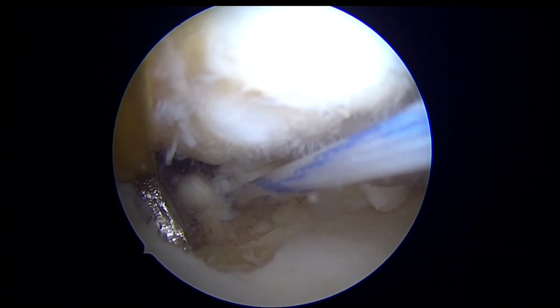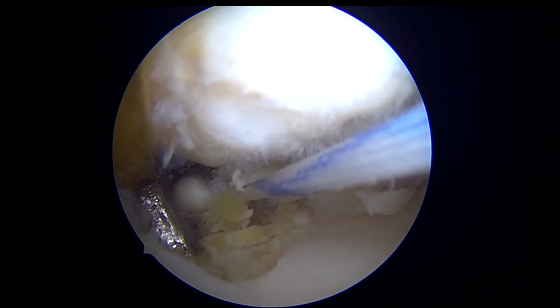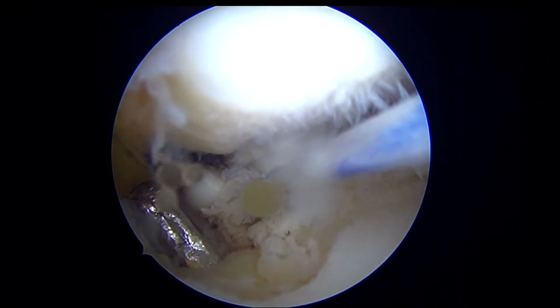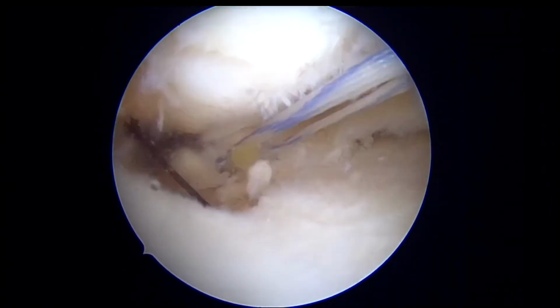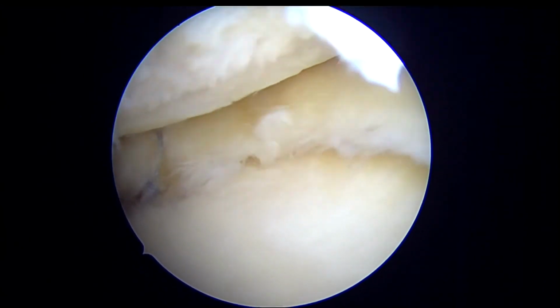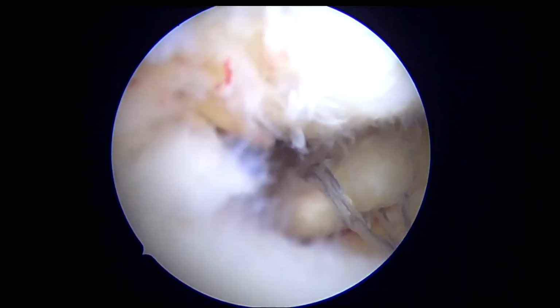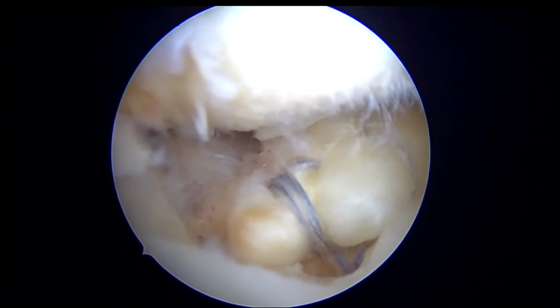Now we'll be preparing the bone tunnel through a jig, and we'll pass a suture shuttle for passing the suture tape down through the tunnel outside over the tibia, where we would tie it over a dog button or a suture disc or an endo button.